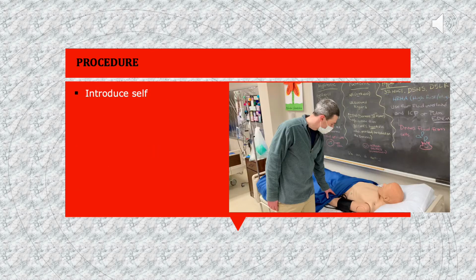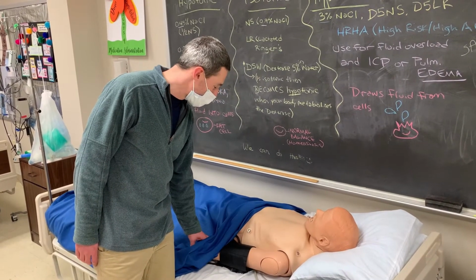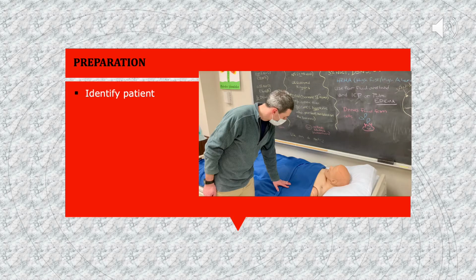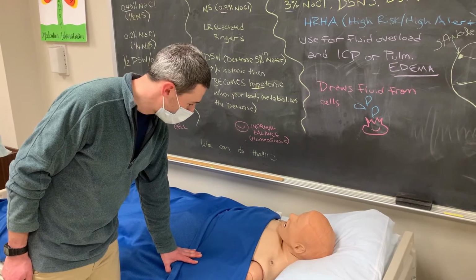Introduce yourself to the patient. Good afternoon, sir. My name is Milton and I'll be your nurse today. Verify the patient's identity using 2 unique identifiers. Sir, can you tell me your name and date of birth?